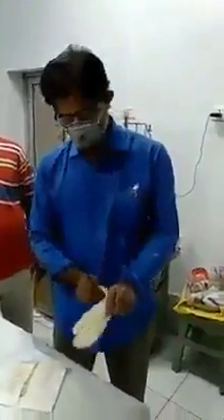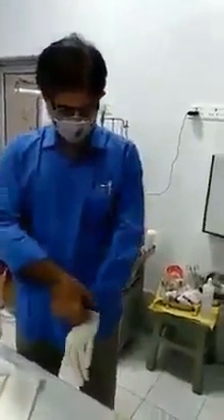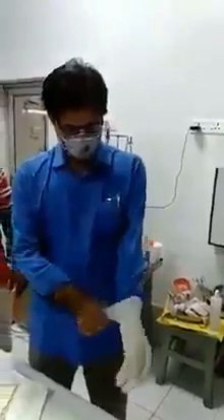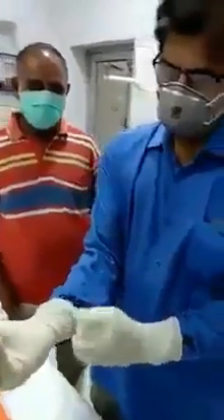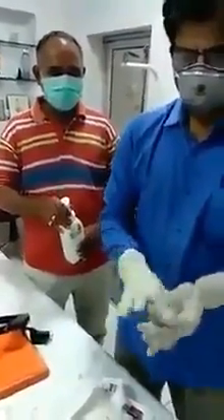This is the second case for which the sampling will be taken by Dr. Ravikant again. He is getting ready and almost ready, sanitizing his hands with sanitizer.